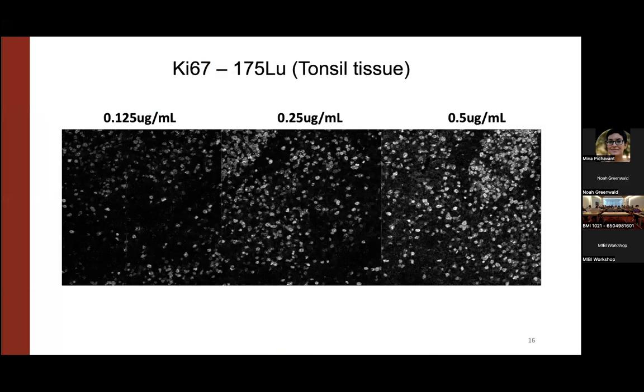All right, now moving on to Ki67. This was one of the examples I gave in the IHC validation as well. Ki67 can be expressed, again, by many different cell types, but what we can use to validate is the subcellular location. Ki67 is known to be expressed in the nucleus. So what we see here is nuclear staining. That gives us some confidence that this clone against Ki67 is binding Ki67.